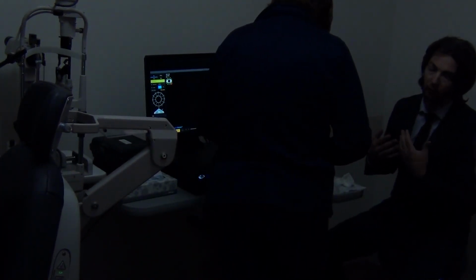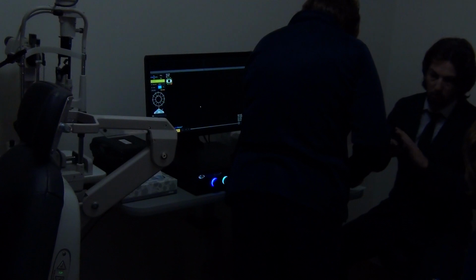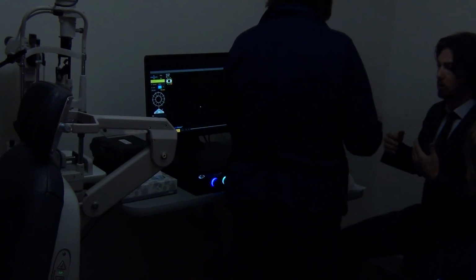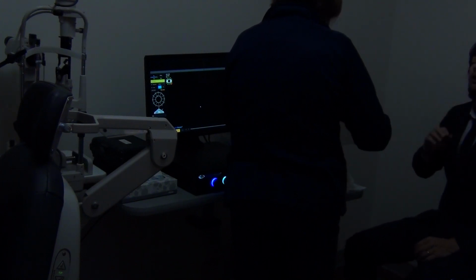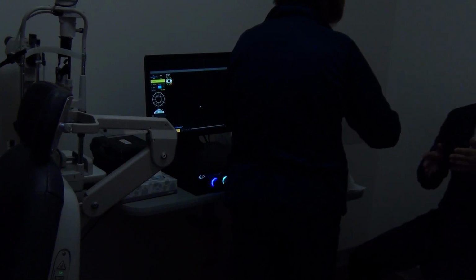And again, of course, it's always best to see the unit in front of you, not on the side. It's the perfect setup. So once you set up the room, make sure you can see the screen in front of you. So you would need to figure out the space and the position. The best way to do the test is sitting straight behind the patient, so you can do both eyes equally. But you can also do it from the side.